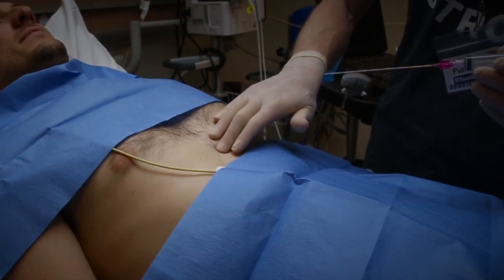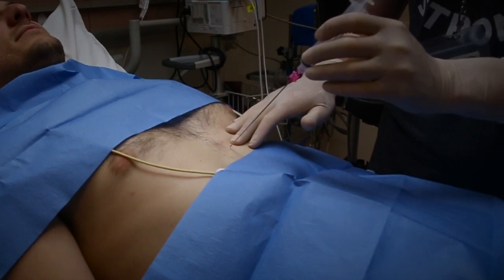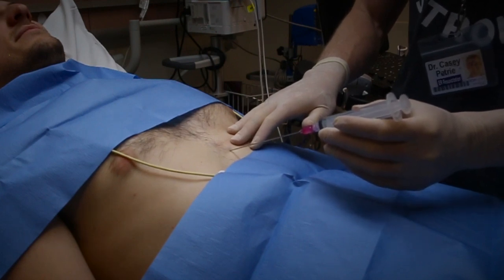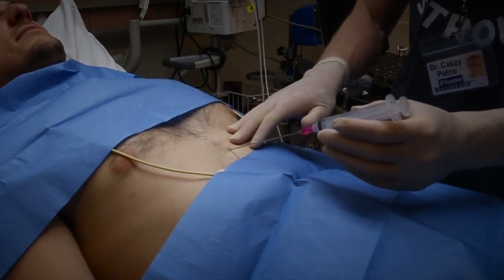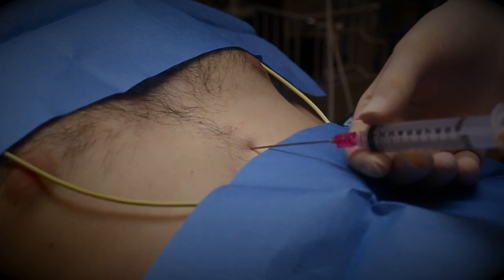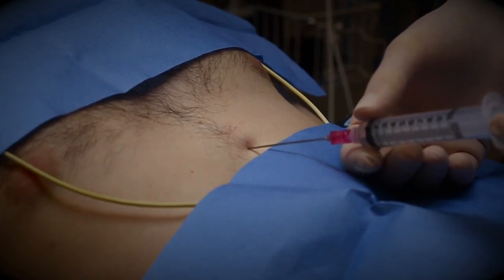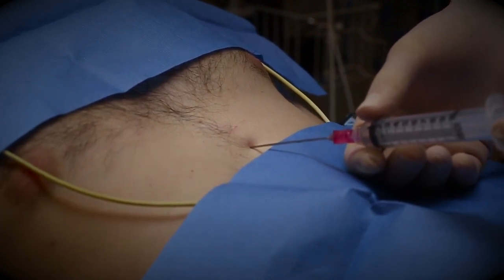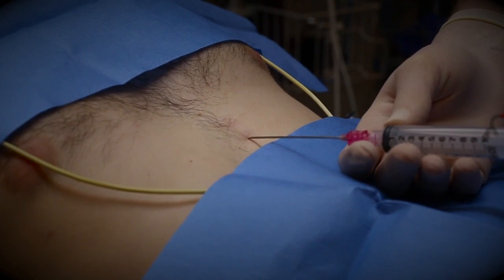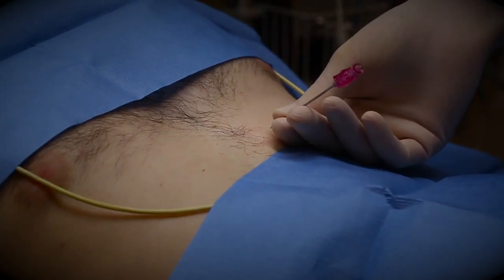Initiate the procedure by palpating the xipho-costal angle on the left side. Insert the needle approximately one centimeter deep and then change your angle to about 30 degrees, pointing the needle up towards the left mid-scapula. Insert the needle with constant negative traction. When you feel the pericardium pop and see a gush of fluid, you'll know you've entered the pericardial space — this may also be acutely painful for the patient. In a cardiac arrest situation, use a large 60cc syringe to aspirate as much as 300cc of fluid.